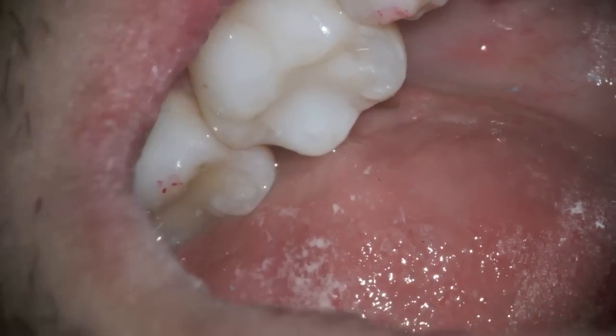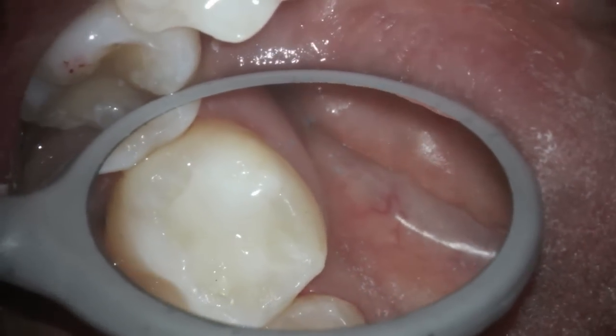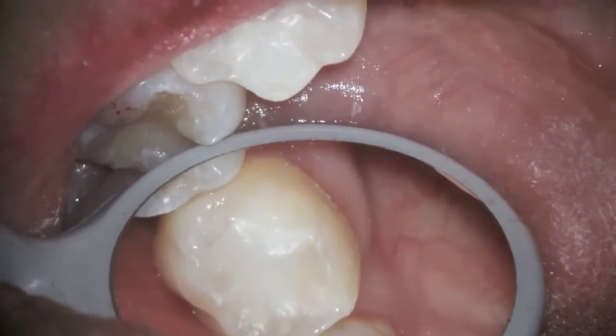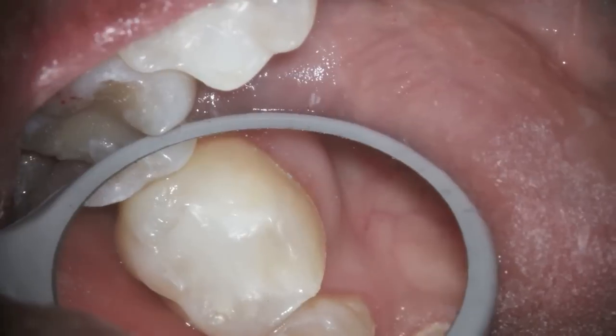Here's the filling — it's a fairly good size. It's polished up. We adjust the occlusion so that the person couldn't chew on it going side to side, but with the actual occlusion they could. Nice and polished, but truly this tooth needs a crown.